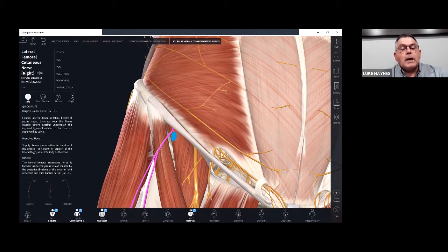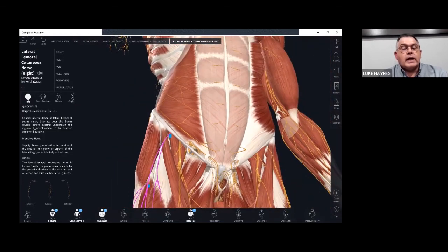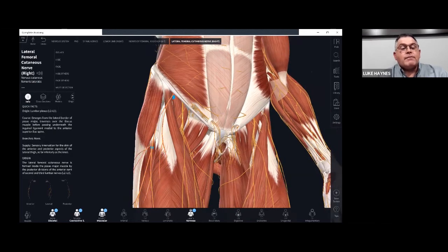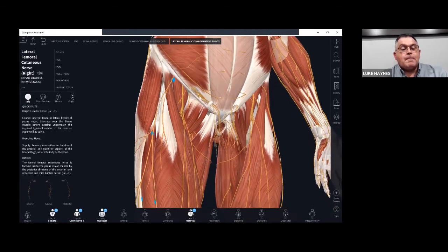So we will come just medial, slightly inferior to the ASIS into this triangle for our initial needle location. That's a nice location to do some unidirectional rotation, bidirectional rotation, some tissue mobilization in that area. We had talked about needling of the inguinal ligament. That would be a nice add-on if we suspect the inguinal ligament to be involved. With that, because we will be very close, we could even add into this needling sartorius and iliacus as well for that condition.